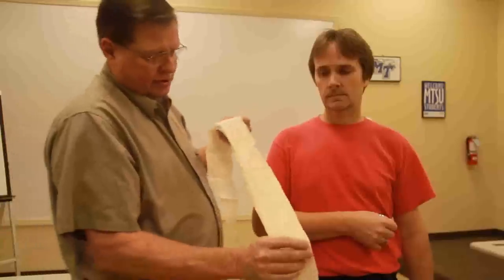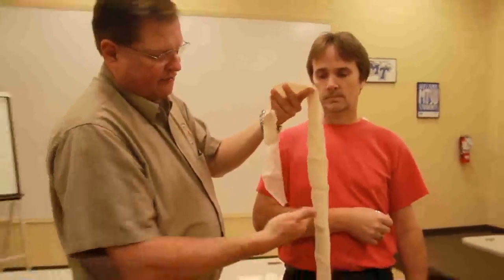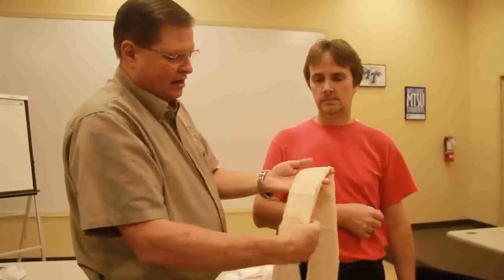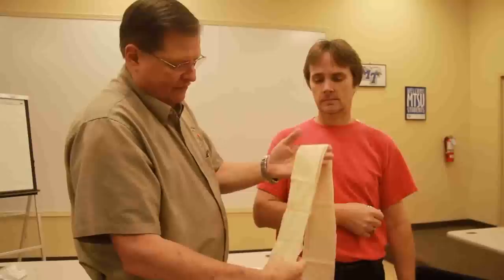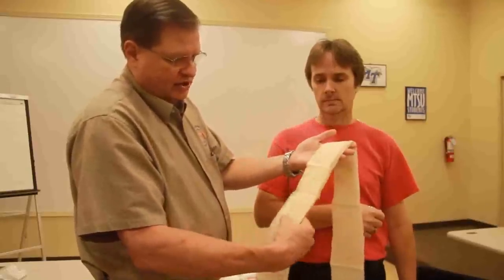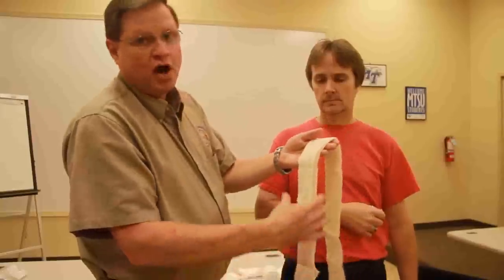The first thing is we're going to get some terminology. This is a cravat. What this is, is a triangular bandage folded into about a three and a quarter, three and a half inch strip. This is called a cravat, and we're going to use it for a swath.